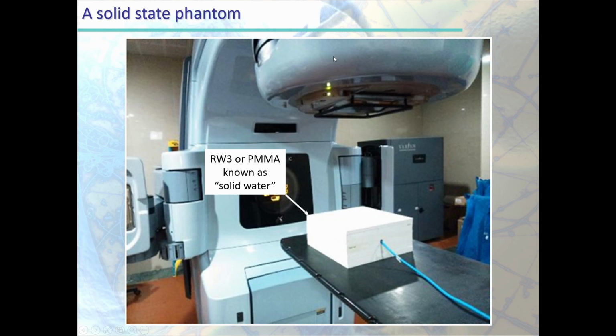Usually people are using a solid state phantom because it's much easier and much quicker than filling the water tank and aligning it. There you have almost the same accuracy, almost the same result, using plates of PMMA or RW3, which is known as a solid water phantom.